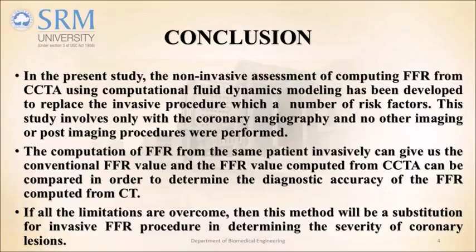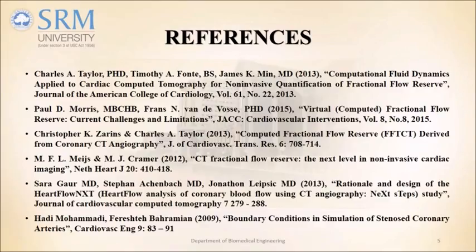The computation of FFR from the same patient invasively can give us the conventional FFR value, and the FFR value computed from CCTA can be compared in order to determine the diagnostic accuracy of the FFR computed from CT. If all the limitations are overcome, then this method will be a substitution for the invasive FFR procedure in determining the severity of coronary lesions. These are our references.